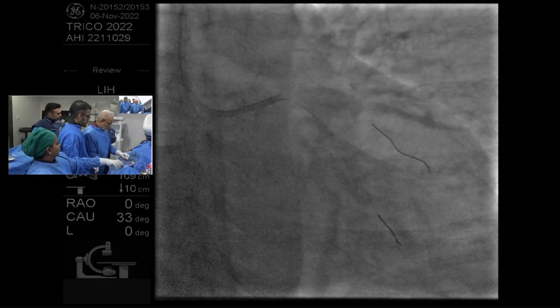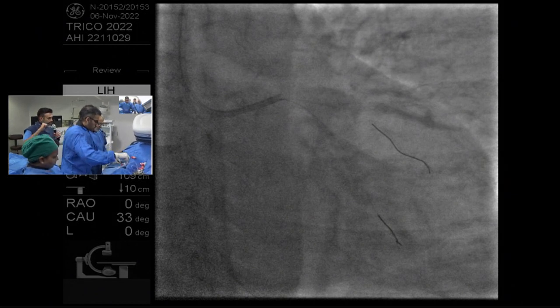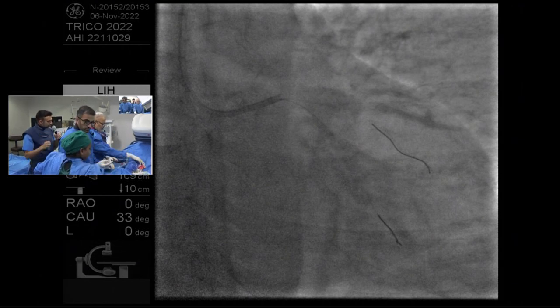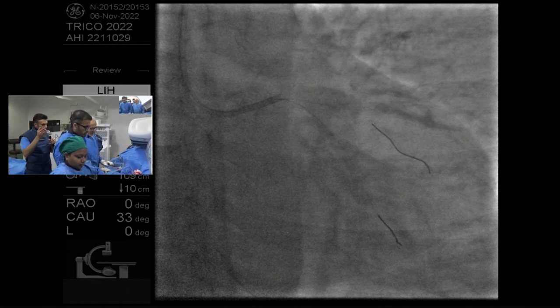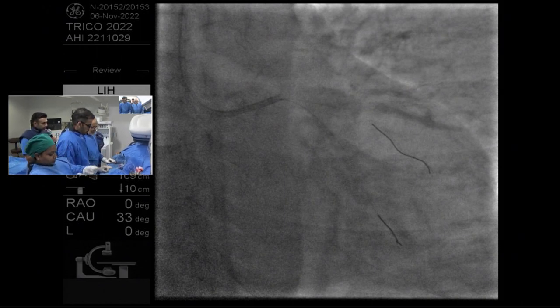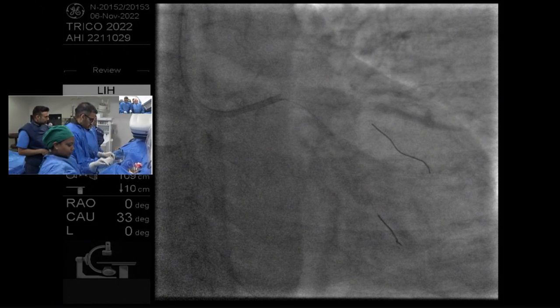And with zero contrast PCI, it's really critical that the guide catheter is well engaged, because if not, your guide catheter is bouncing back and forth, and your length measurements become useless. But if your guide catheter is well engaged and your system is stable, then as you pull back, you actually get an accurate measurement of length on the IVUS. Then when you're starting the IVUS run, you cine, right? That's your distal landing zone. Then you let it pull back, and where you select a proximal landing zone, which is less than 30% plaque, you cine again, right?